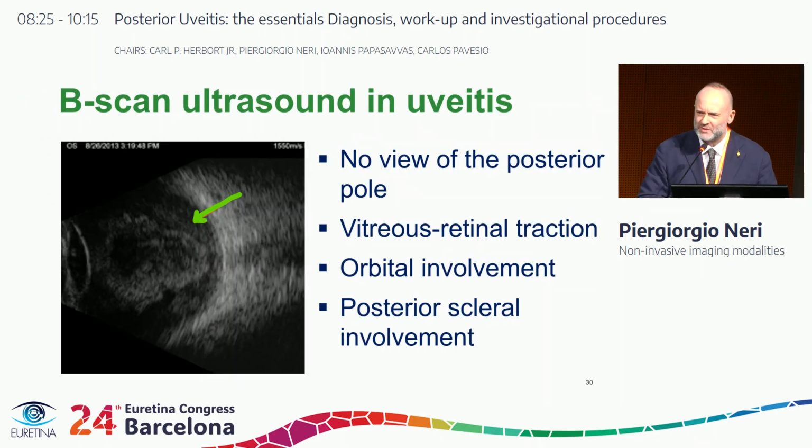It's important to know that sometimes you say, well, did you perform a B-scan ultrasound? Yeah, what a B-scan ultrasound? We got the new machines, super beautiful. But when you have vitreous opacities, it's very important to know what you're looking for.